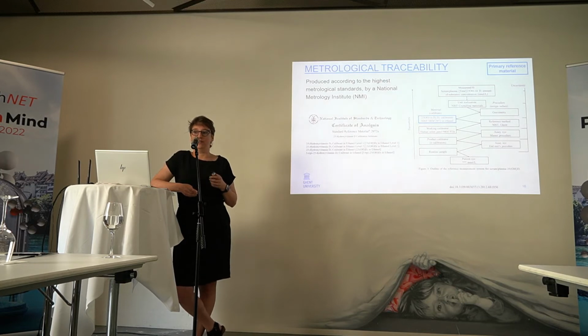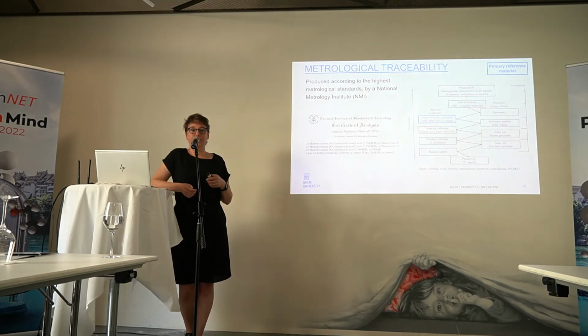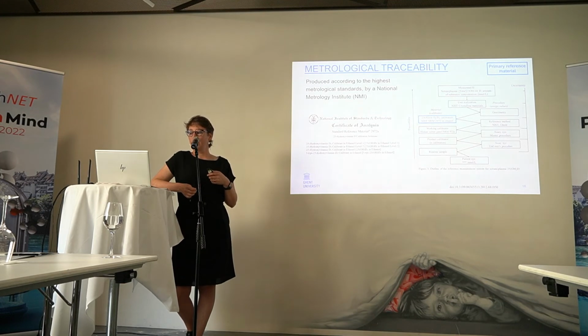I think all of us know the issues for PET, but for example, for 25-hydroxyvitamin D, the primary reference material is actually produced by the National Metrology Institute of the United States, NIST, and it's produced according to the highest metrological standards. It's the same for many other analytes. Sadly enough, there's only one NMI producing a certain primary reference material.